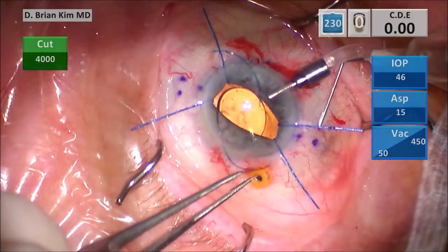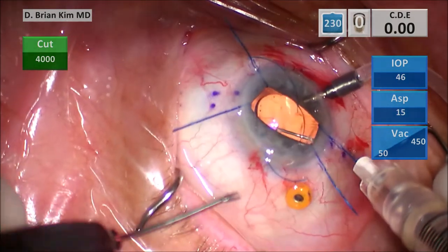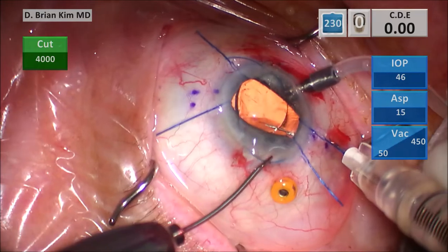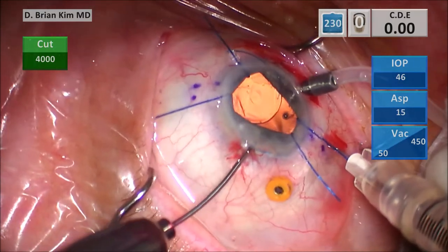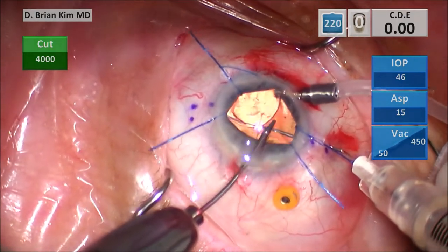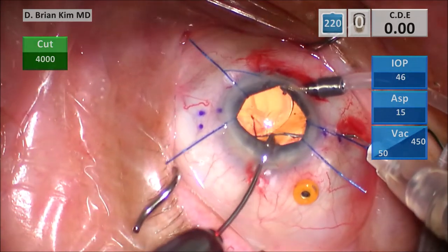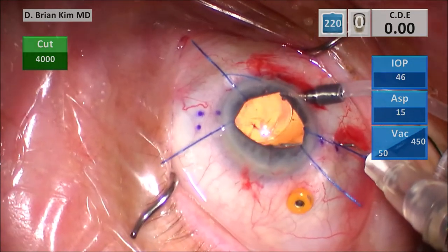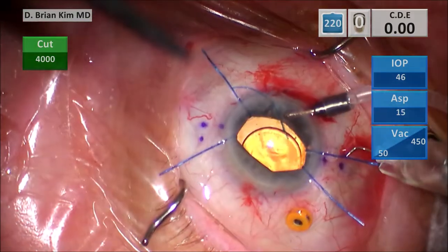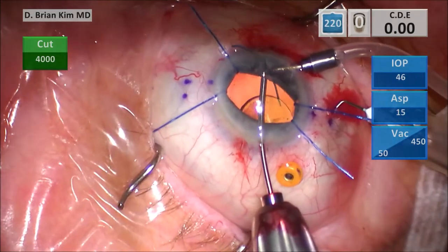Once the lens is fully unfolded, I'm holding the trocar with my left hand, tunneling with the needle 2 millimeters and then going straight down, staying in the same plane. Once I've entered I rotate — you don't want to rotate too prematurely, otherwise you can hit the ciliary body. Very carefully I'm gently sliding the trailing haptic in. These are PMMA haptics — you want to be very careful, but you can flatten it on the bevel of the needle, dock it, and then it just goes in very nicely. You can see very well-controlled, no tension, no stress on the haptic.